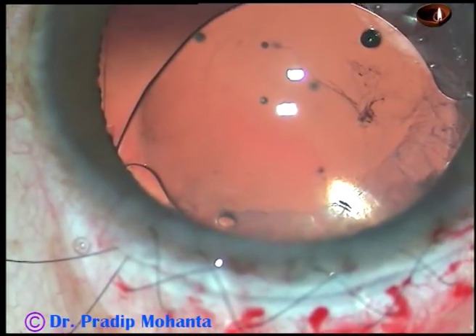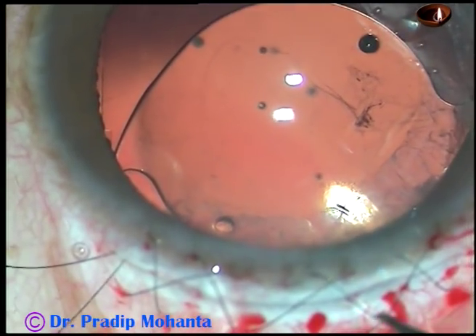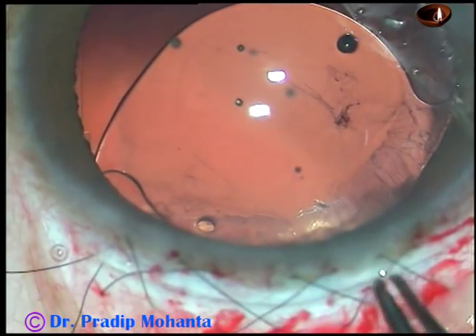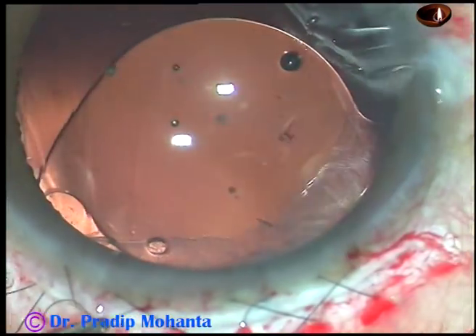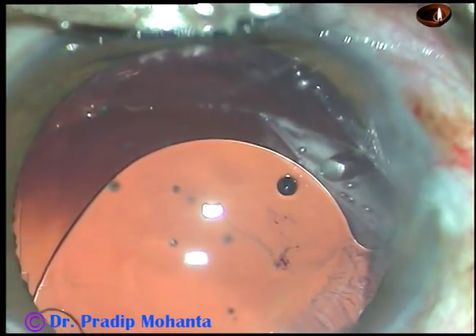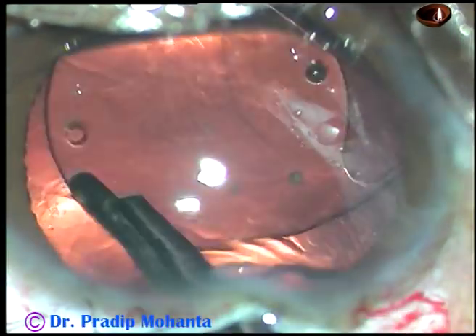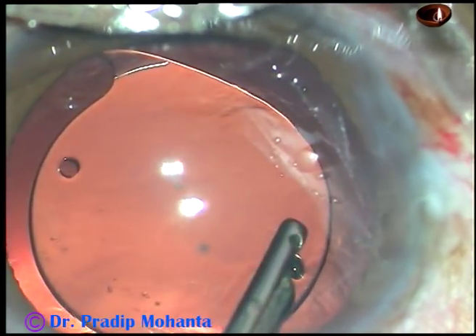Use McPherson's forceps and a straight suture tying forceps to pull the sutures like this. If you pull the sutures like this, it looks beautiful. Now go through this wound without tying it and remove the viscoelastic substance that you have used for implantation of the intraocular lens. Remove the viscoelastic substance very nicely.